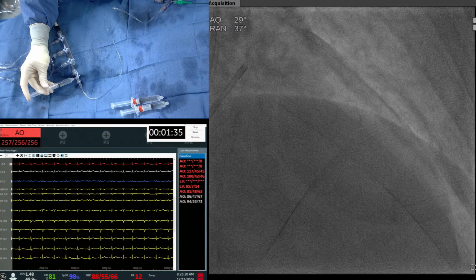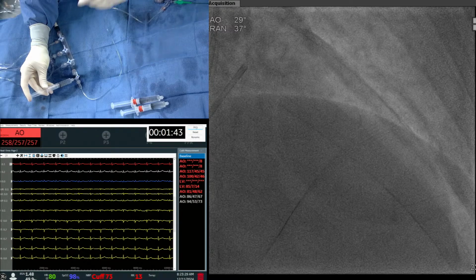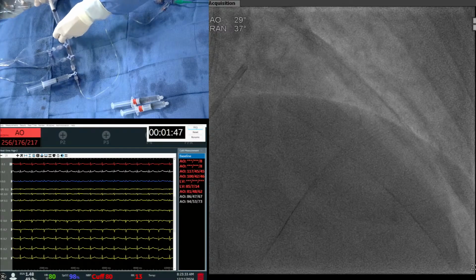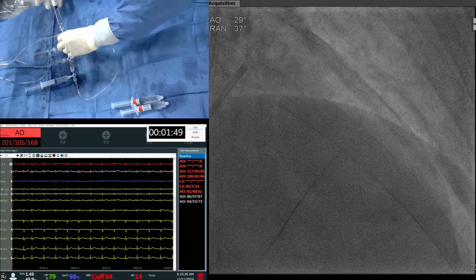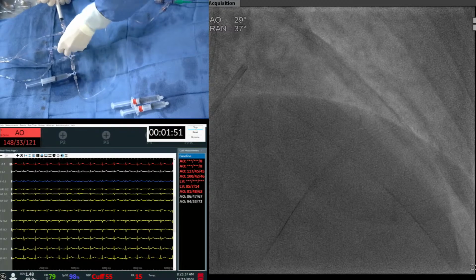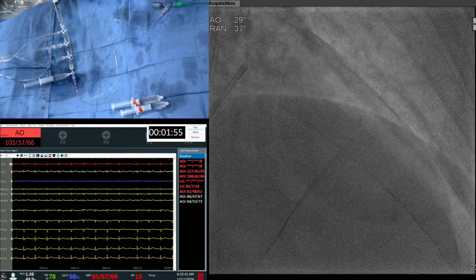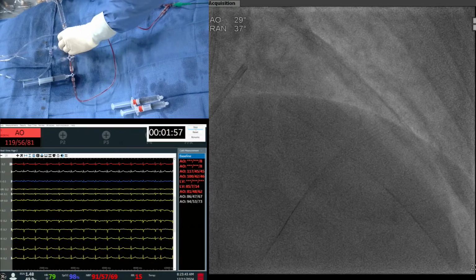So we will generally use it within 24 hours, well, within that same day. We'll mix it and we'll use it for the day. But there have been centers that have done stability testing locally, and this may not apply to all centers, but that it's fridge stable for a week. So we may be a bit conservative on the shelf life and the half life, but I think certainly if you use it within a day and within 4 hours, you're definitely safe.